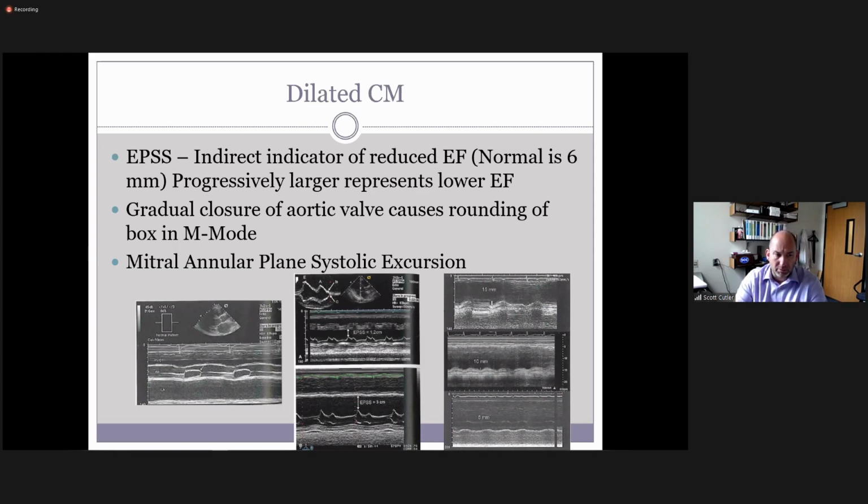basically you want it coming up close to touching the septum. It can touch the septum totally during the time it's supposed to be open, which is in diastole. It should not be touching, as we'll talk about in hypertrophic cardiomyopathies, when the valve is supposed to be closed, or in systole, particularly the end of that, because that's when we have that obstructive disease process, which can cause sudden cardiac death.